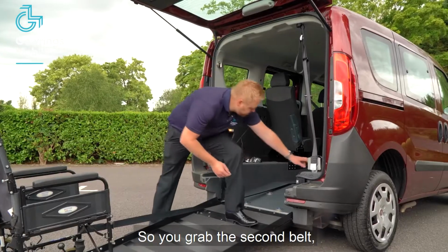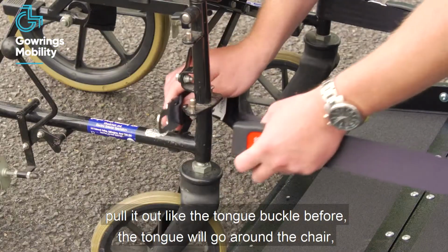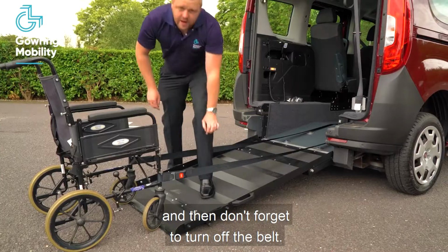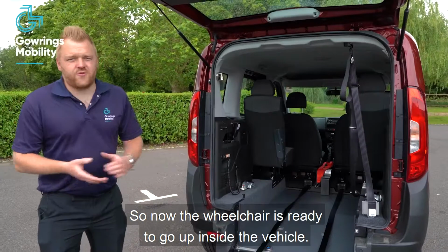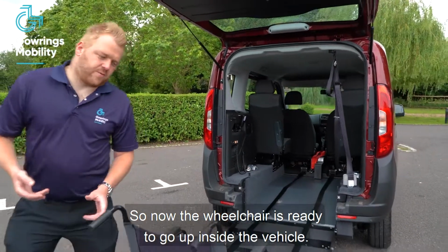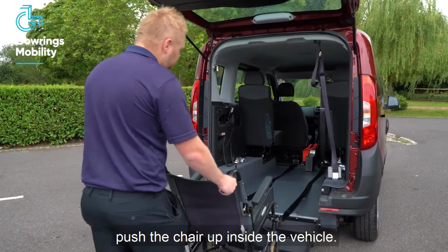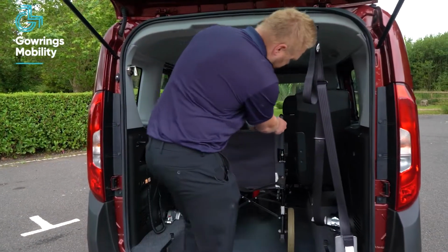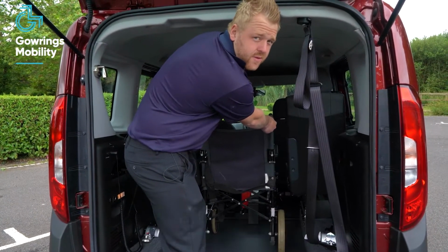So you grab the second belt, pull it out, like the tongue and buckle before. The tongue will go around the chair, clip into the buckle, and then don't forget to turn off the belts. So now the wheelchair is ready to go up inside the vehicle. All you will do is come from behind, push the chair up inside the vehicle, and when you get into position, just pull the chair back slightly to lock the front belts.